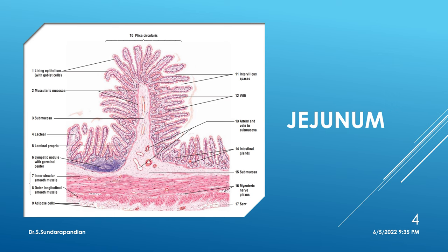So the feature of mucosa in jejunum: you will have villi with simple columnar epithelium — same as duodenum — but with more numbers of goblet cells among the columnar epithelial cells. In the lamina propria you can make out crypts of Lieberkühn. For identification of jejunum, first see all four layers: mucosa, submucosa, muscularis externa, and serosa.